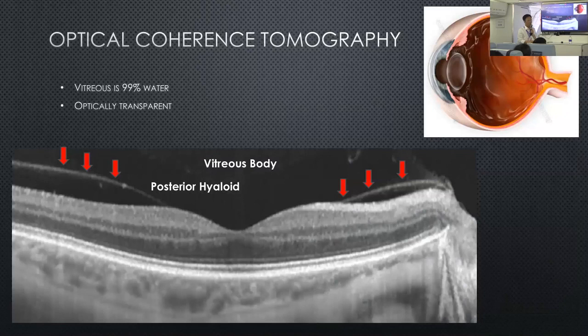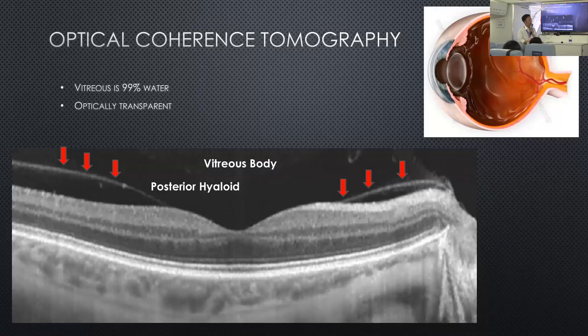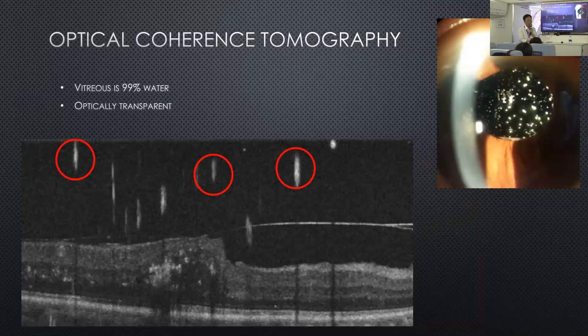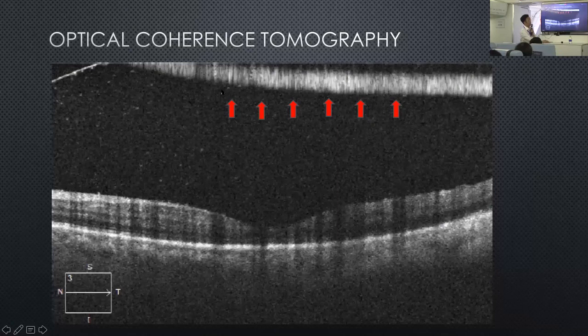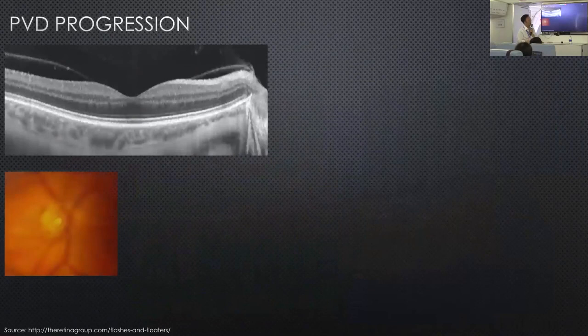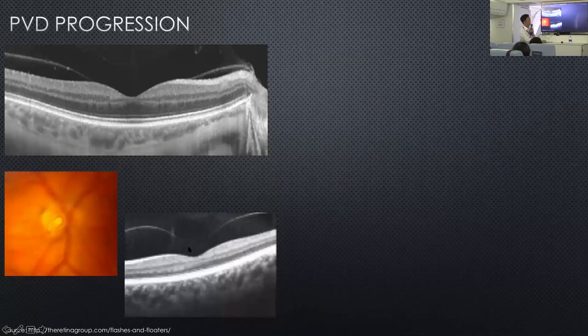We can look at the cross-section from the vitreous all the way down to the retina. There can be something within the vitreous — like calcium deposits of asteroid hyalosis, as in this case — and you can also see a dense hyaloid with blood. Sometimes the vitreous is trying to pull away and the entire hyaloid can be easily seen on the images.